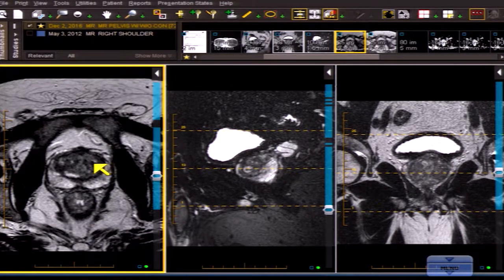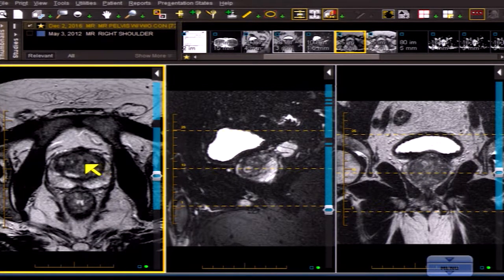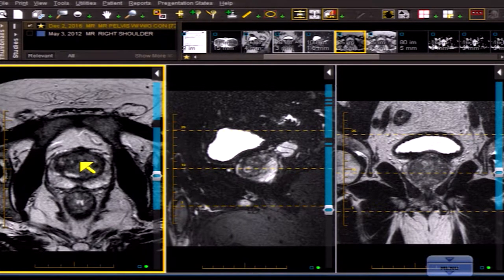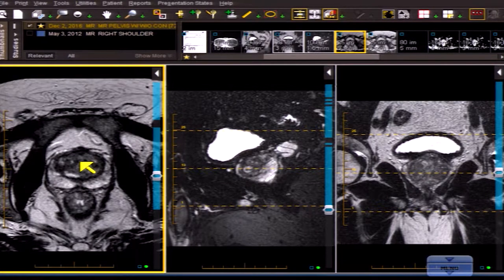A focal abnormality is kind of a synonym for a focus, but with some nuance: a focal abnormality can be any sized abnormality, whereas a focus is usually something more pinpoint — millimeters in size. A focal abnormality has some size to it with a little mass effect but is well defined from the rest of the structures. The index lesion is the highest PI-RADS assessment category lesion.